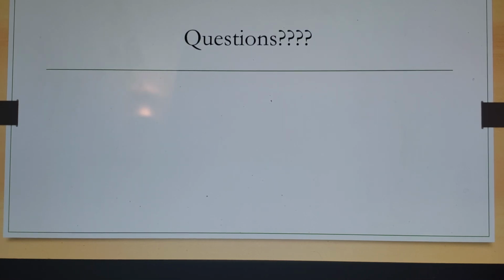And that's really it. Questions? Like I said, I always appreciate your feedback. Again, don't rely on the machine interpretation. Don't get overwhelmed. Try to think about the different, your P wave being your atrial problems, your QRS being ventricular problems. Remember your HOW BAD mnemonic. You might save someone's life by picking up a Wellens or a Brugada syndrome in somebody who's asymptomatic, or even a hypertrophic cardiomyopathy. So hopefully this was useful for you, and it'll help improve your EKG interpretation.